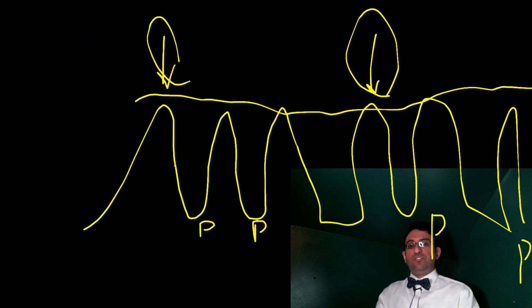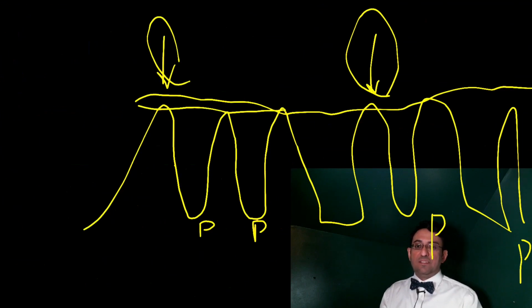And so this is another example of a condition in which the patient has some control. This is pressure support ventilation. Just pay attention to my terrible drawing in the part that the peak pressures are equal.